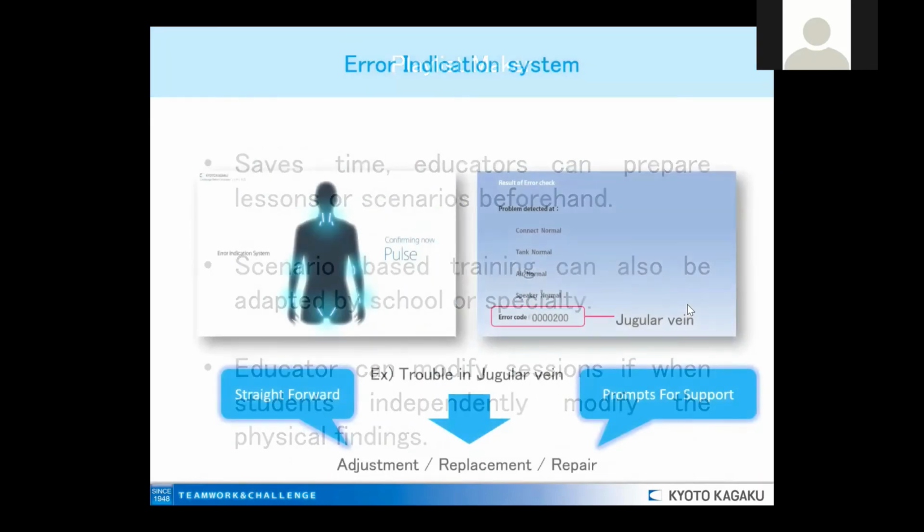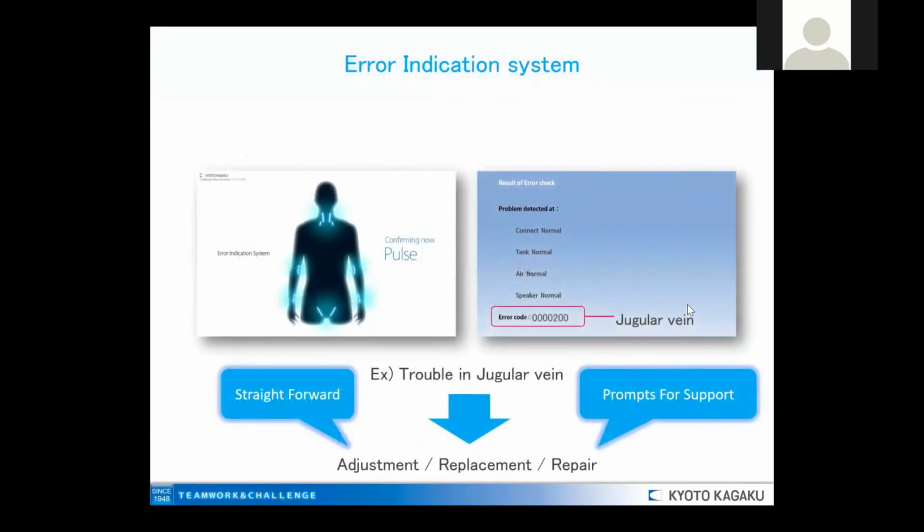And as an additional comment about the operation of the model, we have included an error indicator system at the beginning of the operation of the model.